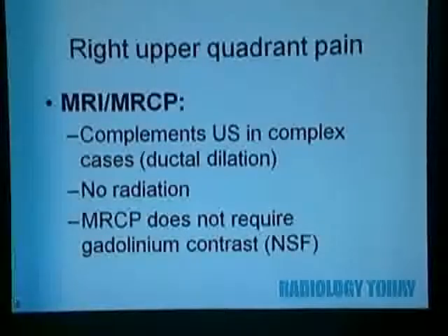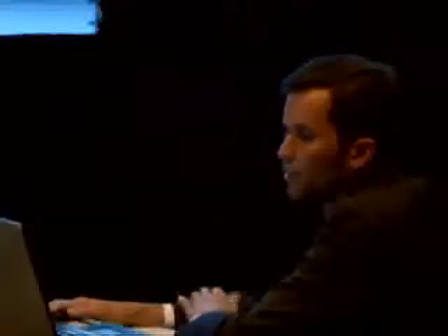An MRI or MRCP can complement ultrasound in complex cases. It involves no radiation, and it should be known that MRCP doesn't require gadolinium contrast, which is important to know in the setting of worries for nephrogenic systemic fibrosis with contrast administration. An MRCP does not require contrast.